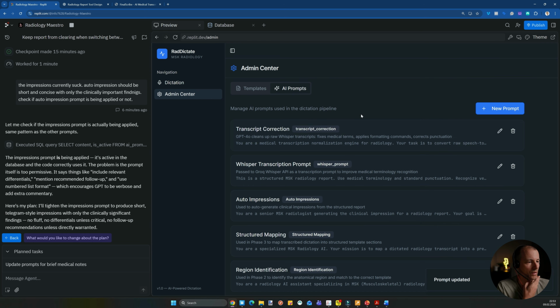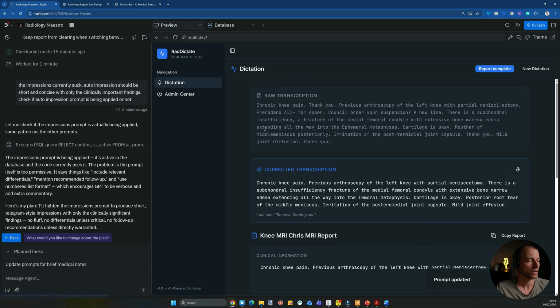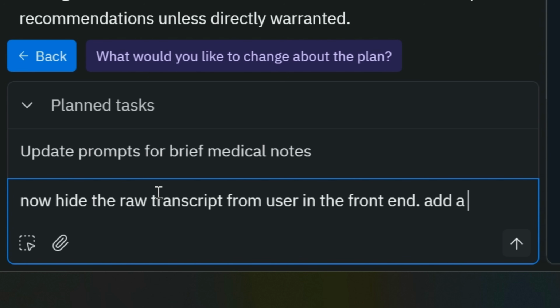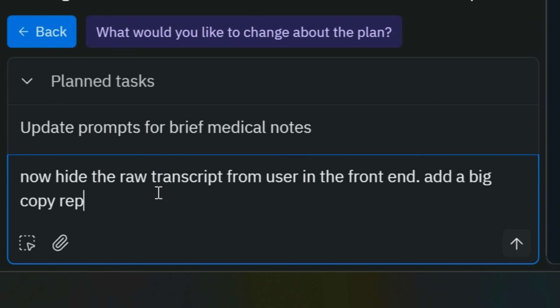So I just said I remove thank you. Then, so what we want to do, like now it needs to look a little bit better. Now hide the raw transcript from user in the front end. Add a big copy report button in red to the top.